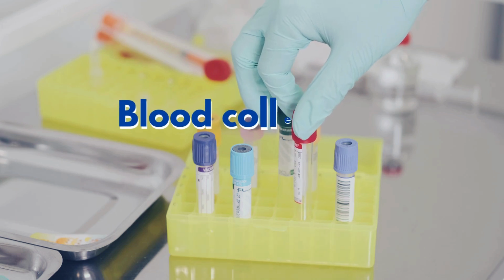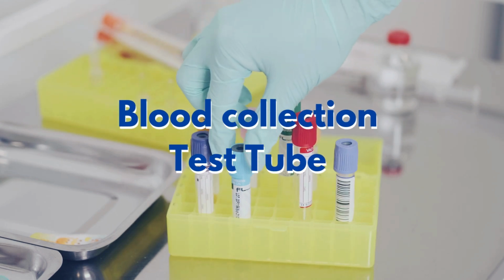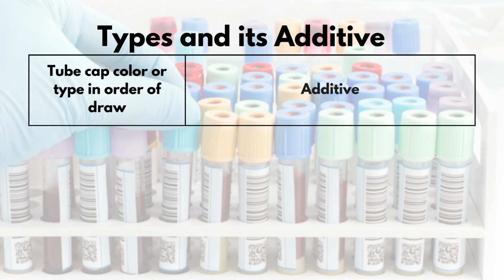It is important to take blood samples in different types of blood sample tubes because each tube is designed to support specific types of tests and ensure the quality and accuracy of the results. The differences between tubes lie in the additives they contain, which can influence the way blood is processed. Certain additives, or the absence of additives, are necessary to preserve the integrity of the analytes being tested.